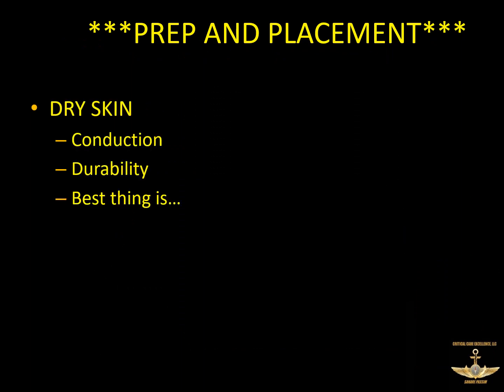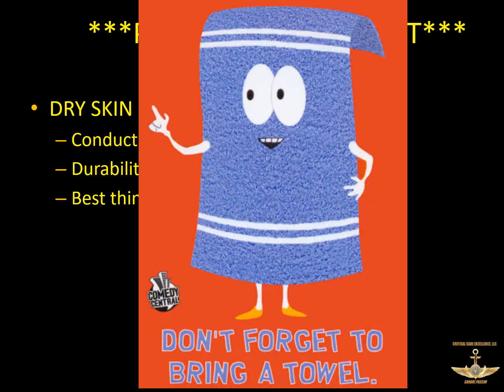And finally, and this seems like a no-brainer, but you always got to say it, the skin has to be dry. This will help the electrodes stick. It'll help for conduction. It'll help for durability of those electrodes sticking to the skin. When you ask what helps skin dry the best, I hear all kinds of stuff. I've heard of agencies that carry deodorant or antiperspirant spray, all kinds of stuff. Honestly, the best thing to dry wet skin is a towel.